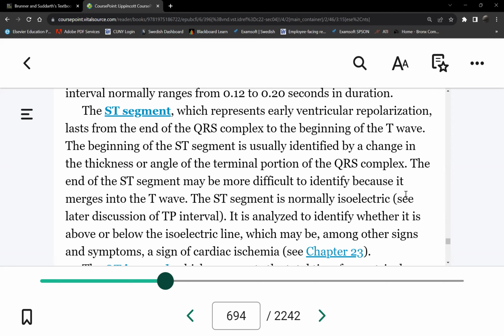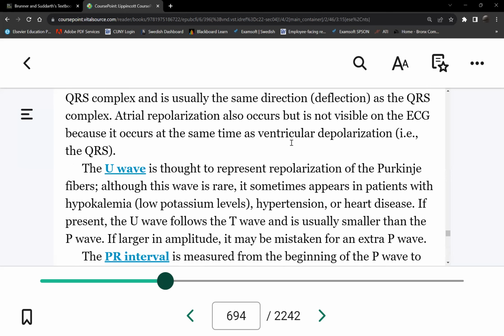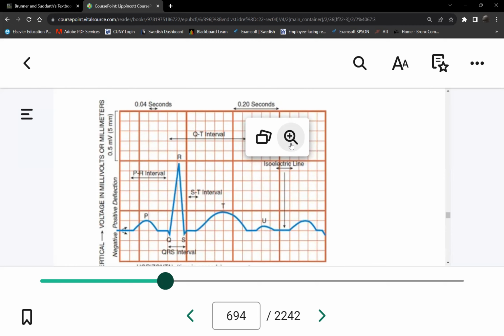Okay. So later, when we go to acute coronary syndromes, which is next semester, the ST segment is normally what? Isoelectric, supposed to be flat. Now, in the case where it becomes abnormal, the ST segment can either be elevated, meaning instead of starting here, it starts here. The ST will deviate. The ST segment starts here and looks like that before it becomes a T wave. We call that ST elevation. That's classic myocardial infarction, patients having an active heart attack. Or it can also be a non-ST elevation MI, still an MI, wherein it looks like this.